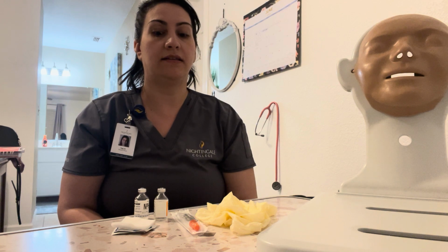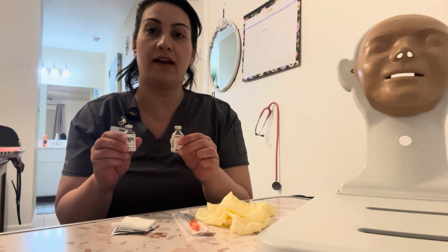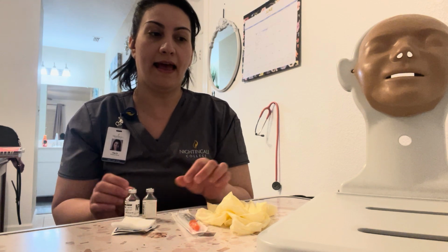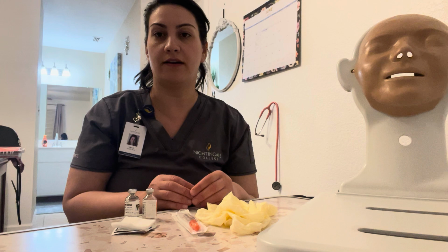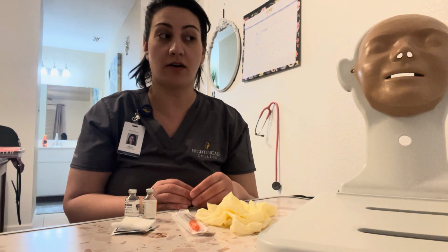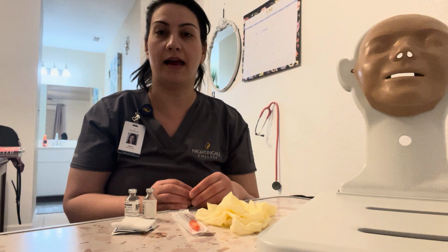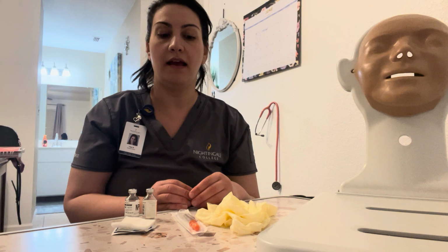No questions. All right, 3rd time of verifying against the MAR. So I'm going to have a nurse here by me, and we're going to get started. She's going to be confirming the amounts individually and the amount together, equalizing 12 units of insulin.